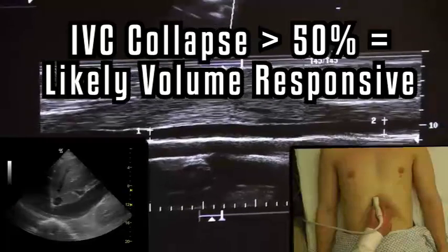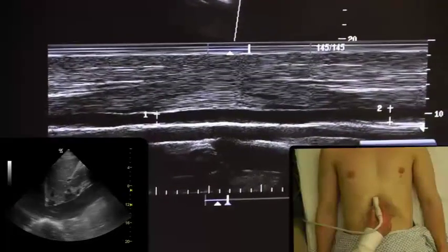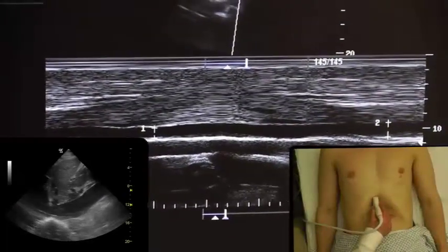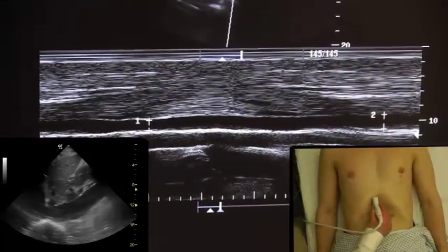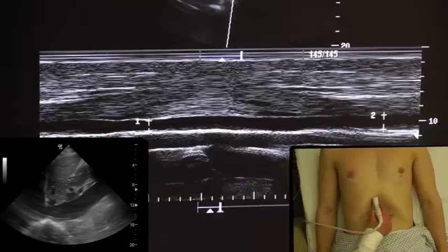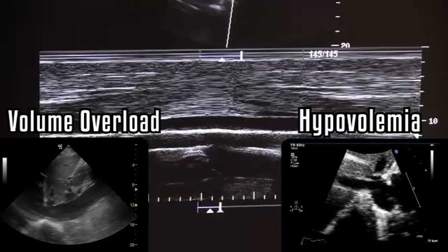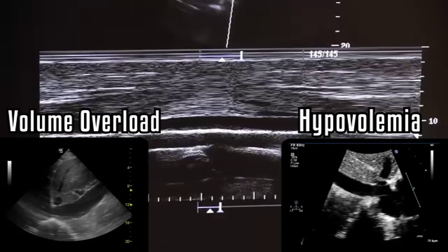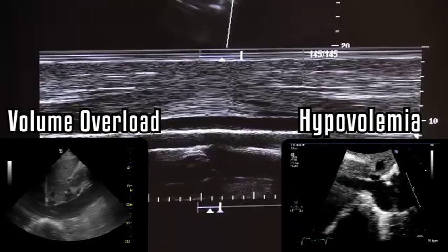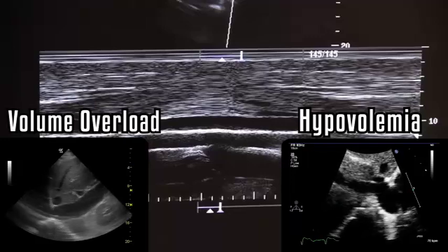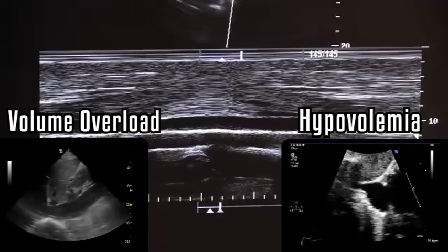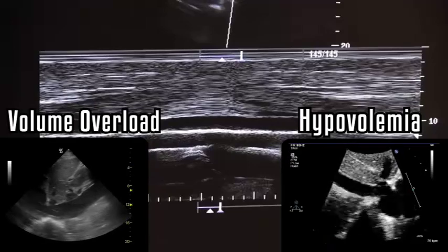The image on the left shows a patient who is volume overloaded — note how the IVC doesn't change with respiration. The image on the right shows a patient who is hypovolemic — note how the IVC collapses in on itself and is obliterated by inspiration.